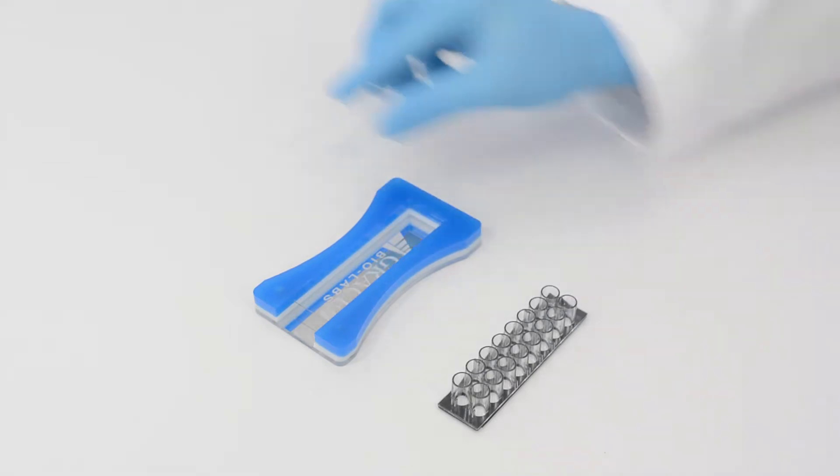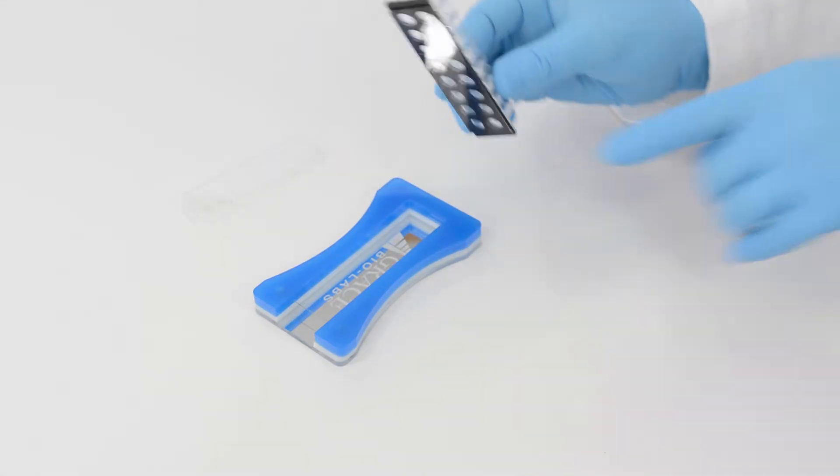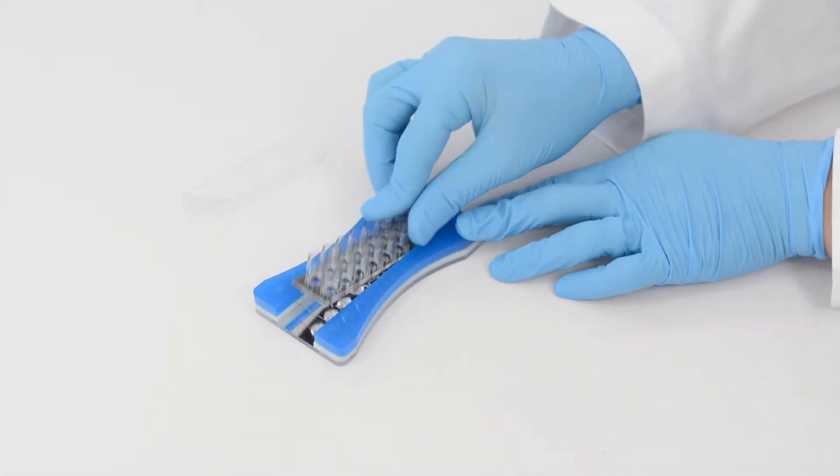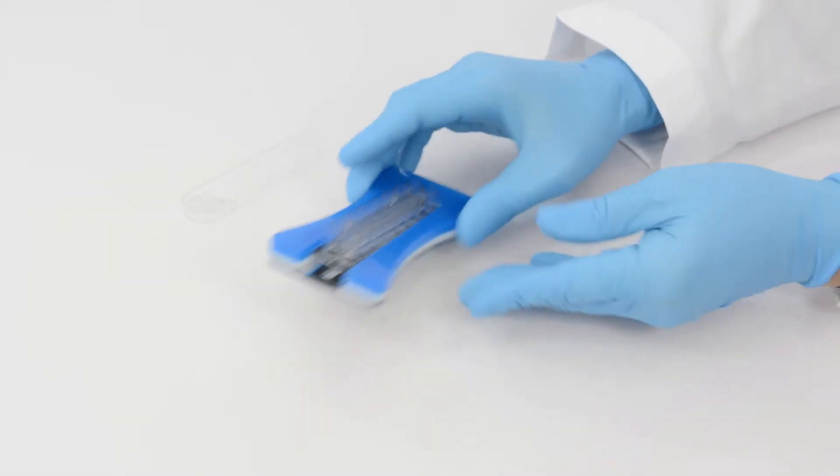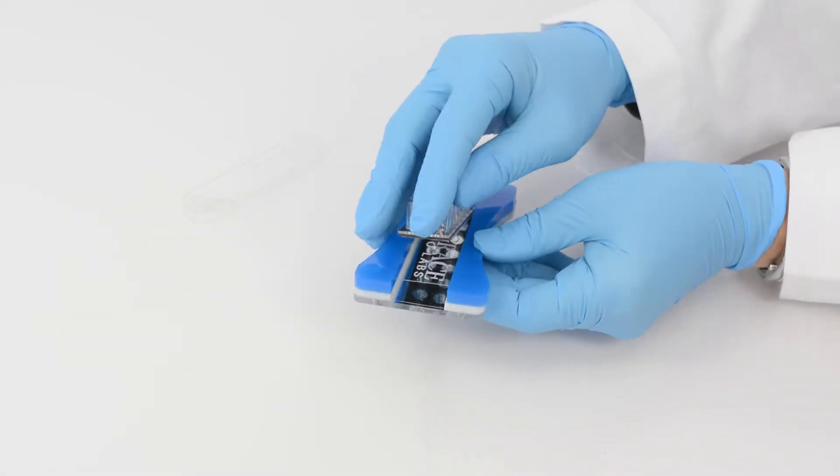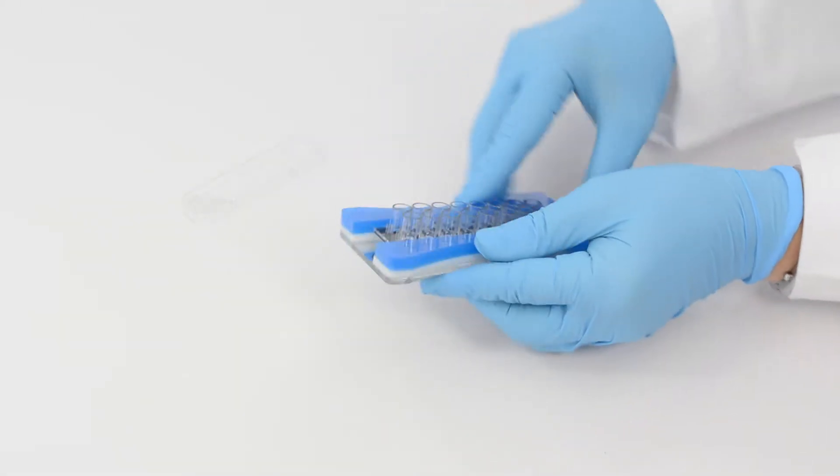Start by aligning the back of the CultureWell chambers with the back of the removal tool. Now the edge of the coverglass should sit directly behind the wire in the removal tool.